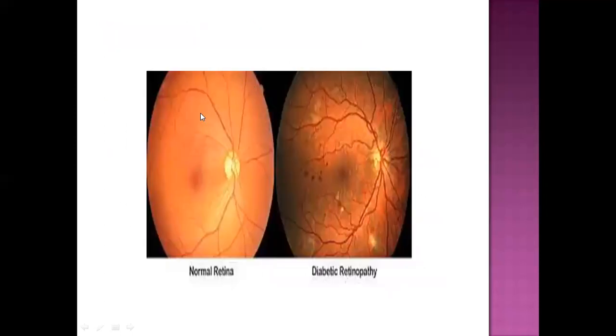As you can see, normal retina looks like this in the fundal examination, and a patient having diabetic retinopathy. Diabetic retinopathy is one of the complications of diabetes. Diabetic retinopathy condition looks somehow like this.